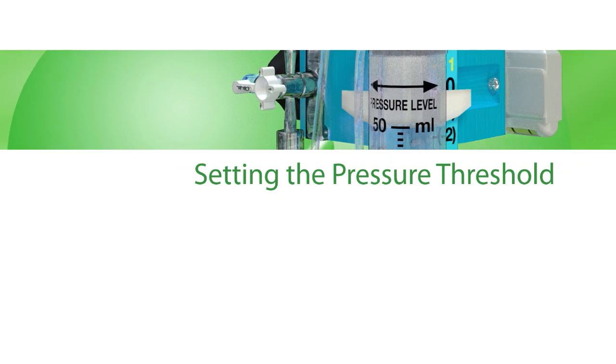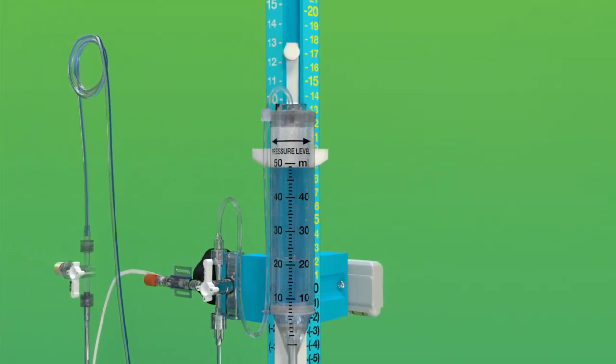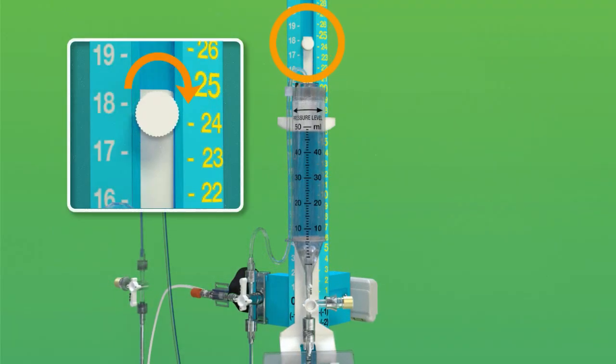Setting the Pressure Threshold. Raise or lower the drip chamber to the pressure setting prescribed by the doctor. The prescribed pressure number should be aligned with the white plastic wings on the drip chamber bracket. Tighten the drip chamber locking screw.